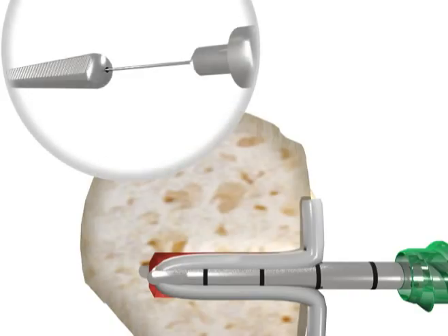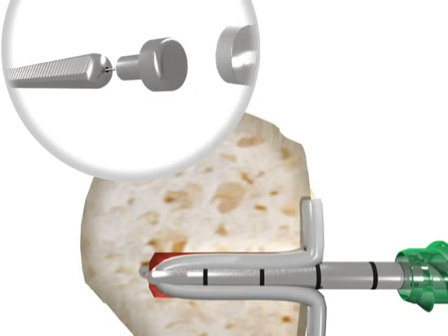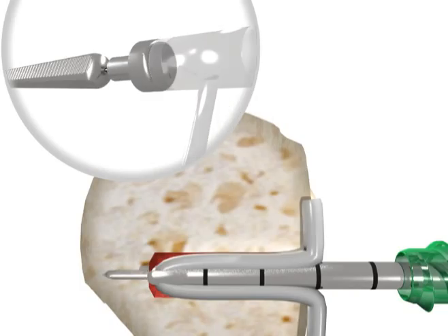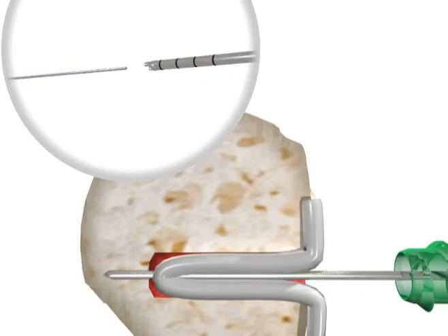Insert the 1.5 millimeter tendon pin through the cannulation on the tendon fork. Attach the bi-grip pin puller on the back of the tendon pin and mallet the pin until it bottoms out on the handle of the tendon fork. Remove the bi-grip pin puller and the tendon fork, leaving the 1.5 millimeter tendon pin in place.